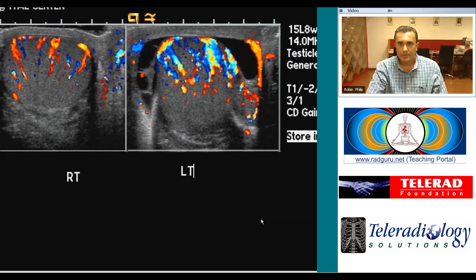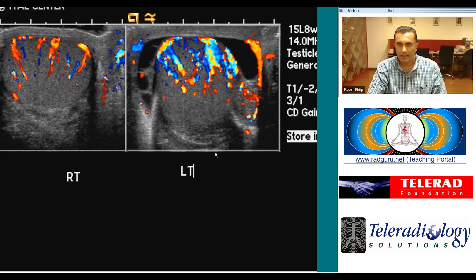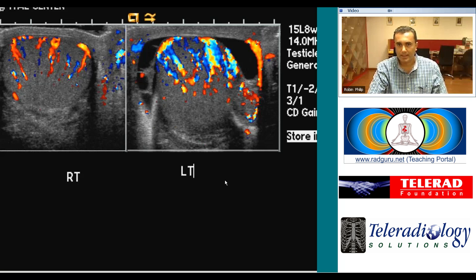Here's an ultrasound of the scrotum on a patient with left testicular pain. The most important image on a scrotal ultrasound is probably this one, where the technologist has shown the two testicles side by side on two separate frames captured on a single image. The purpose of this is to compare the two testicles, particularly the vascularity — which is essentially the most important reason for doing scrotal ultrasounds: to determine whether flow to each testicle is preserved, interrupted as in testicular torsion, or increased as in acute inflammatory conditions such as epididymal orchitis.